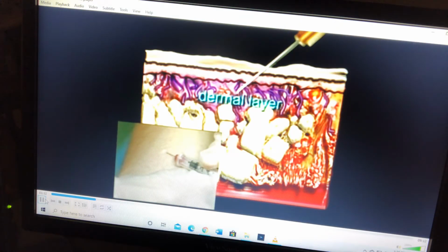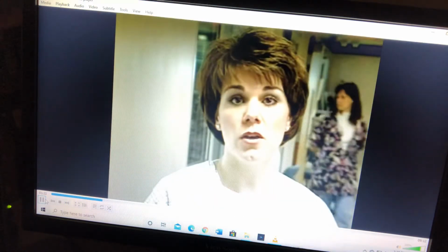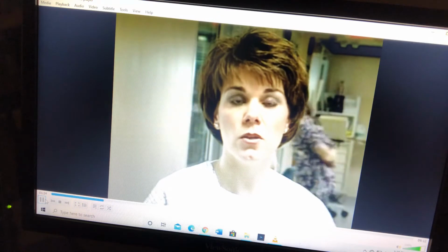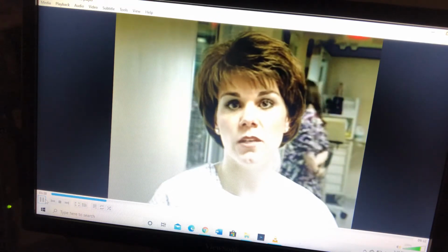Intradermal injections are given into the dermal layer of the skin just beneath the epidermis. This route is used to administer small volumes that require slow absorption. This route is typically used for allergy testing and tuberculosis screening. This route can also be used to administer a local anesthetic prior to a procedure, such as the insertion of an intravenous catheter.